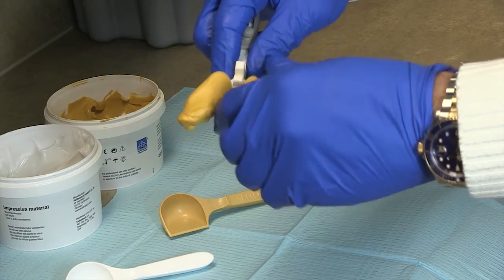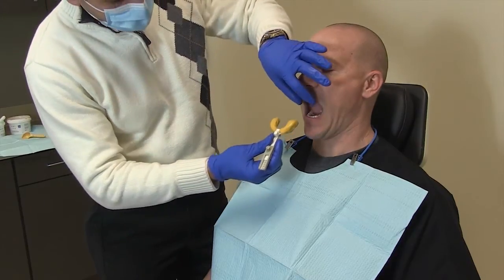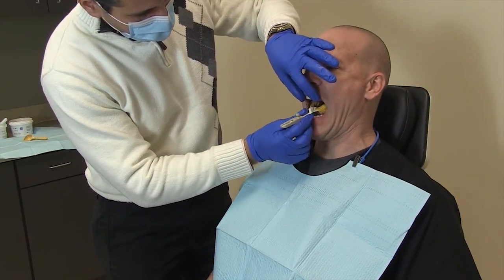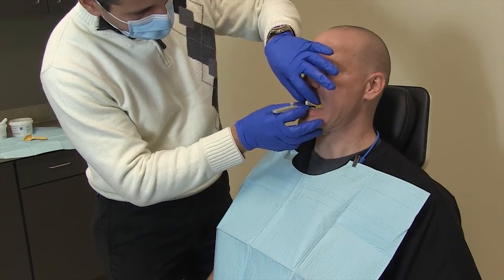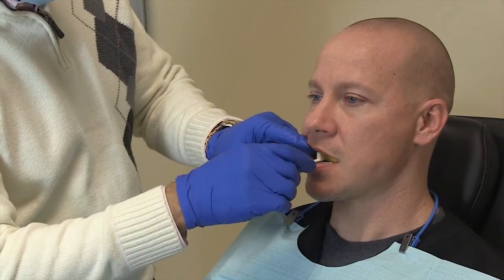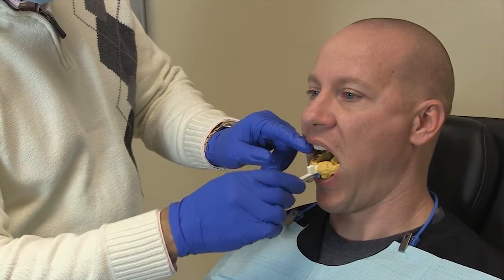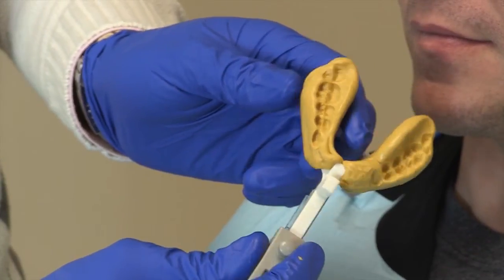Use the putty as demonstrated in this video to capture the occlusal relationship. Remember to capture the last clinical crown to the anterior teeth. SomnoMed prefers not to adjust the vertical dimension from the provided occlusal relationship. Proper use of the George gauge will result in better wing-lug relationship, less premature posterior contacts, and a flat occlusal scheme.